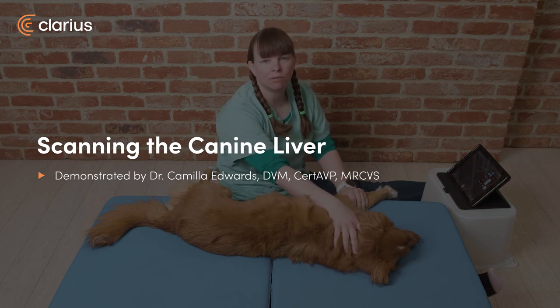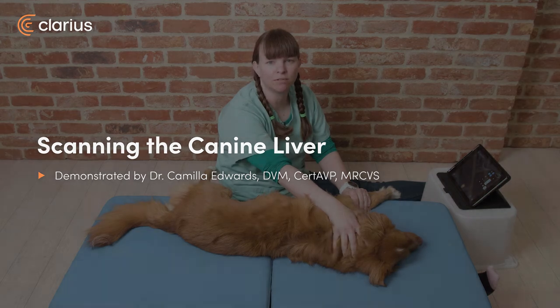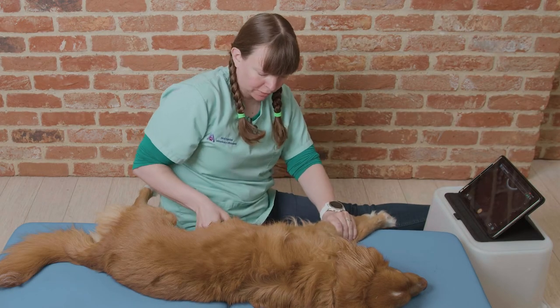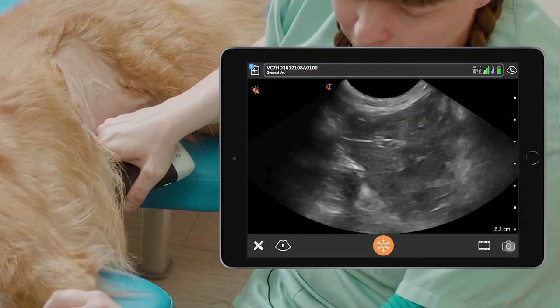Hi, I'm Dr. Camilla Edwards from First Opinion Veterinary Ultrasound, and today we'll be looking at how to scan the liver of a dog. To scan the liver of a dog, we first place the probe behind the xiphisternum and point cranially.